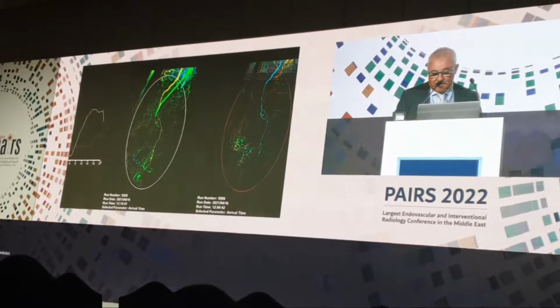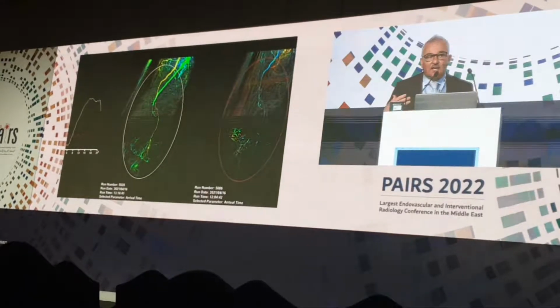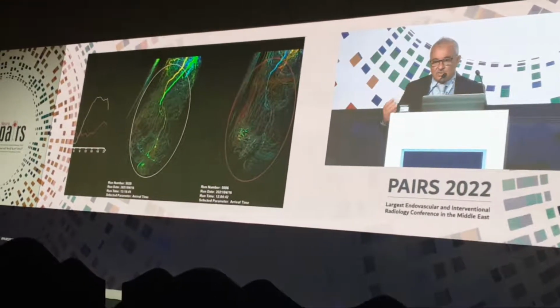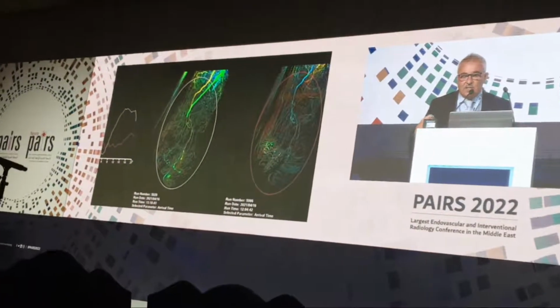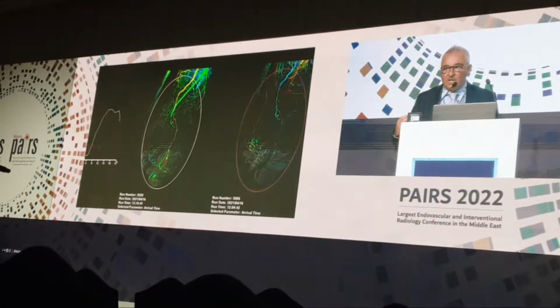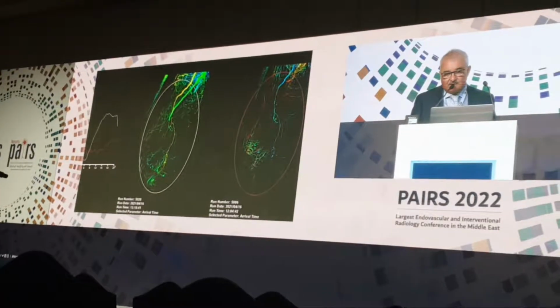Well, after this procedure, we can discuss why we directly used drug-coated balloons in this case: because of the complexity of the wounds. When we have this kind of severe, huge wounds, we have to try to maintain patency for as long as possible.